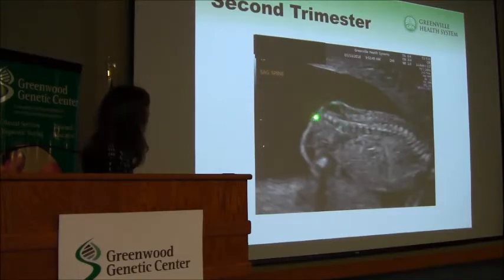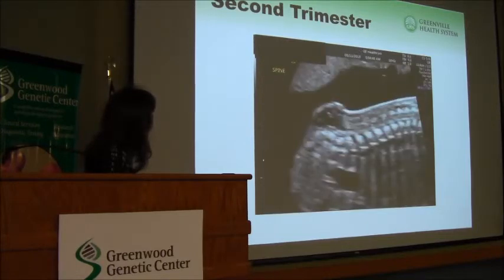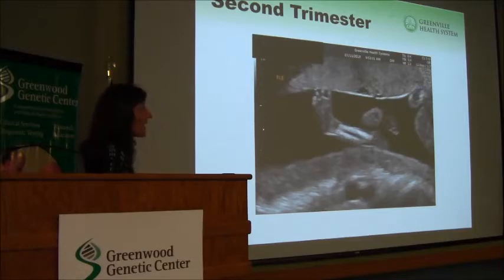And you can actually see how the skin is raised there, and then they've got the cystic structure, a little close-up of the same defect. This was what happens downstream in the lower extremity with these neural tube defects. We can get clubbing of the foot.